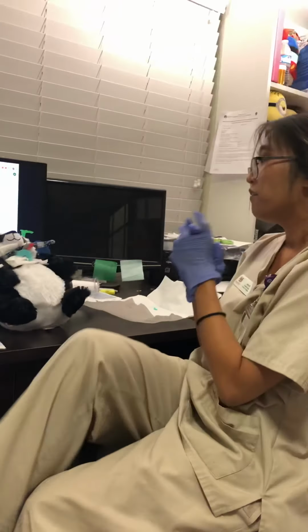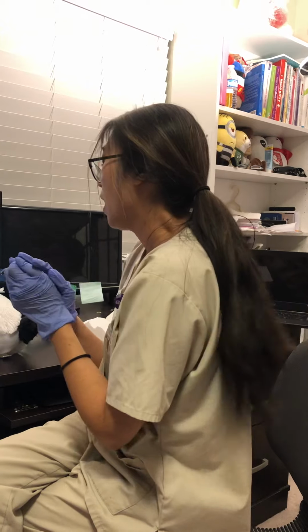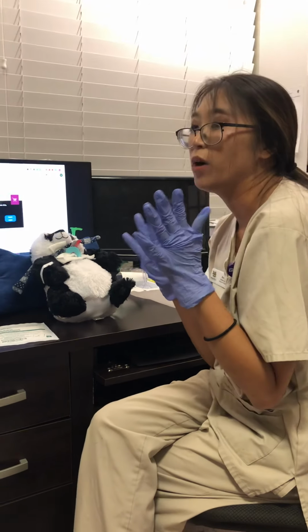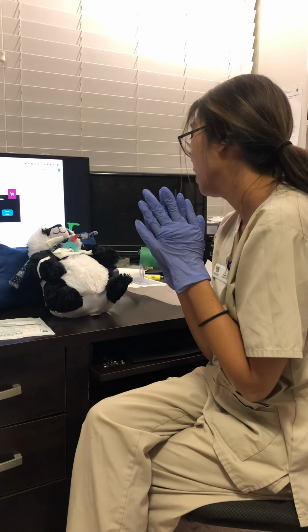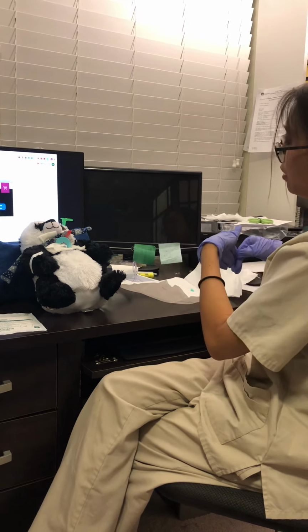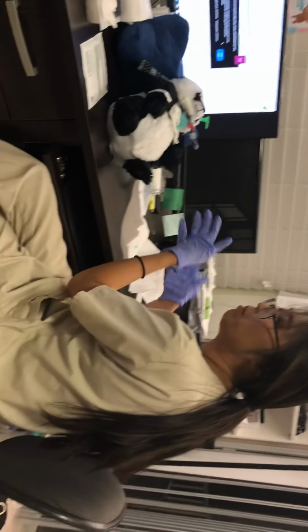That's great. First, now I'm going to put him into a Fowler position, but I put the gloves on first because the sterile gloves you can only use once. You cannot put them back on. So we're pretending that this is a sterile field. You would have the drape over your patient, you would maintain your sterile field, and you would have your hands above your hips.